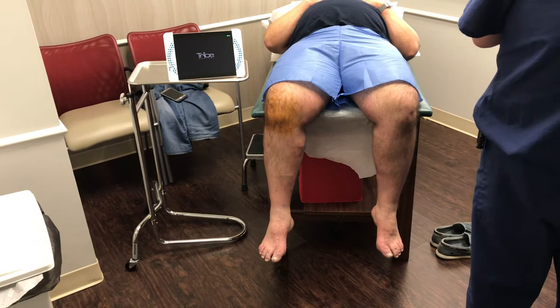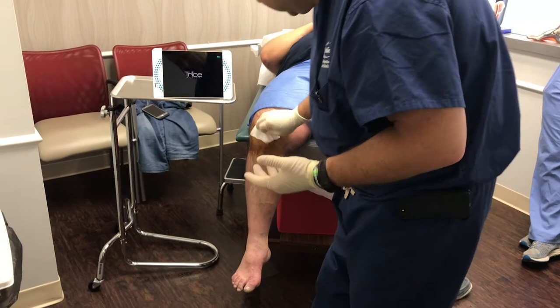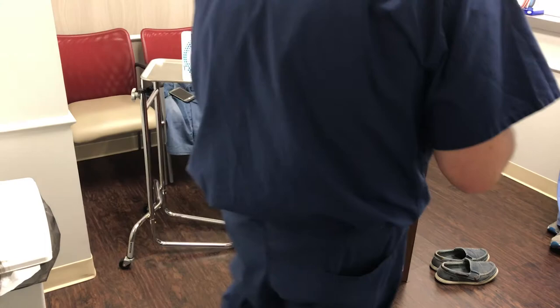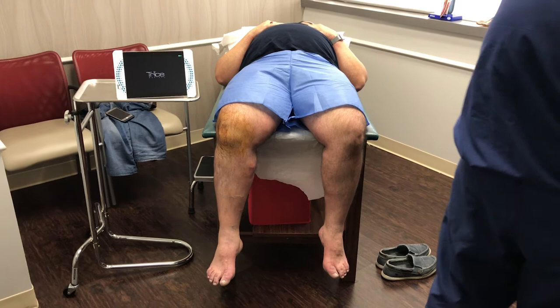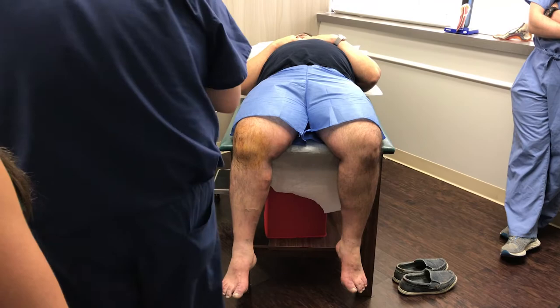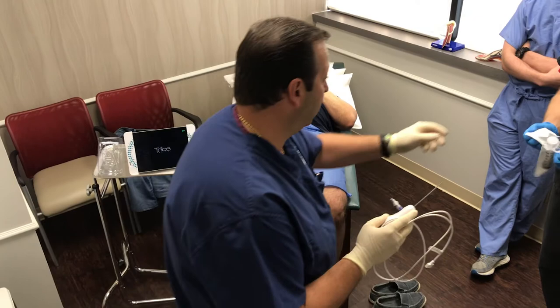It showed a very small, very questionable possible small tear in the meniscus, but it was really iffy — it was on one image — but you're still having symptoms. So that's why we've talked about this: it gives me a clear view. MRIs can show a tear, just like anything they can miss it. One of the problems with an MRI is, just because it shows a tear, it doesn't really give you a lot of detail about the tear. There are tears that are there but they're not really a problem, and then there are tears that are causing mechanical symptoms. One of the things I really like about this is when we see the tear, we know what kind of tear it is. We can tell — is this a real tear, is this a tear that's going to cause symptoms, or is this something that an MRI picked up that really doesn't mean anything?